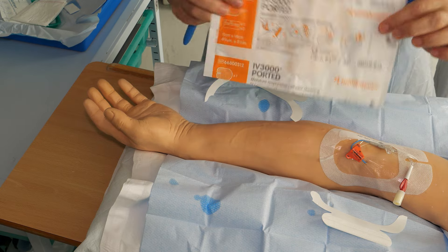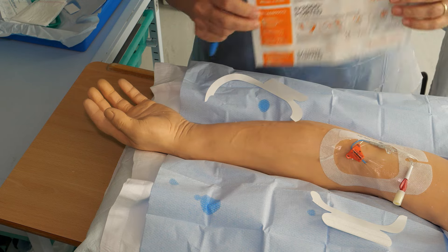If you have had some reactions to the standard dressings used, you may be supplied with a sensitive dressing.